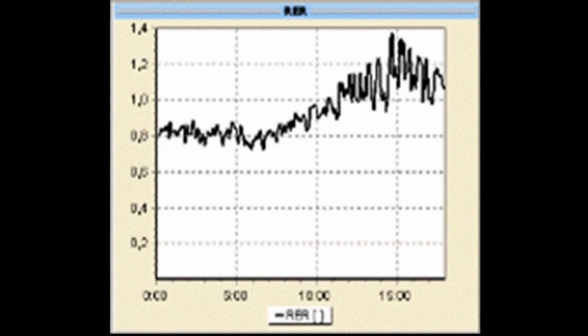This panel can be seen as the most important panel for a physiotherapist. With the help of interpreting the RER, one can evaluate if the test was performed properly and the patient reached his maximum. This often needs additional motivation from the therapist during the test in order to reach an RER higher than 1.2. In the beginning of the test, the subject has an RER of approximately 0.8.